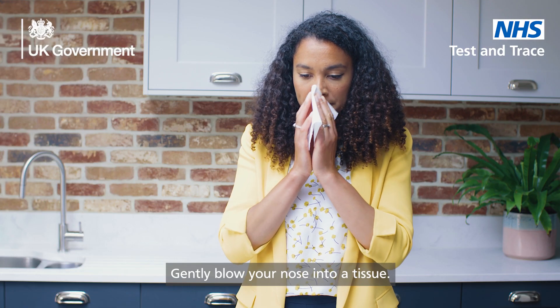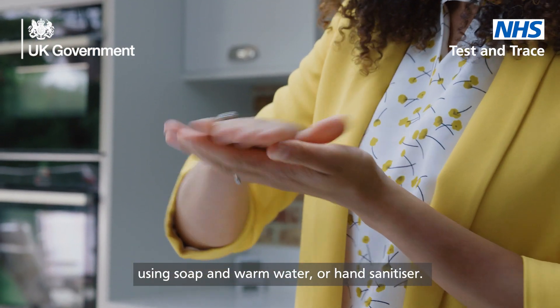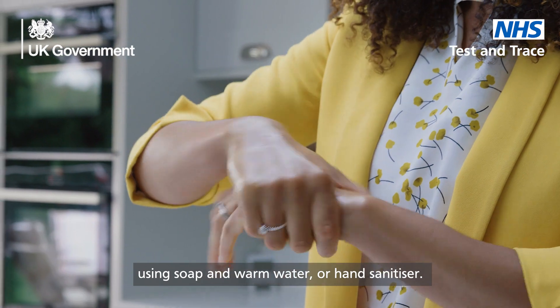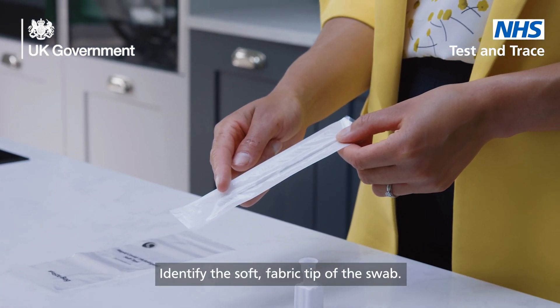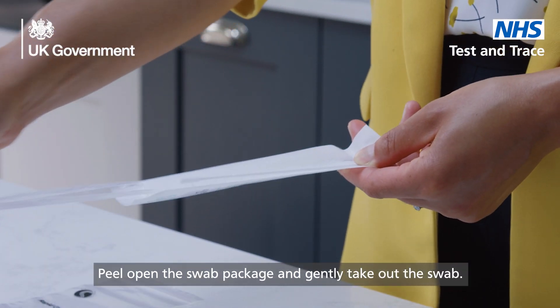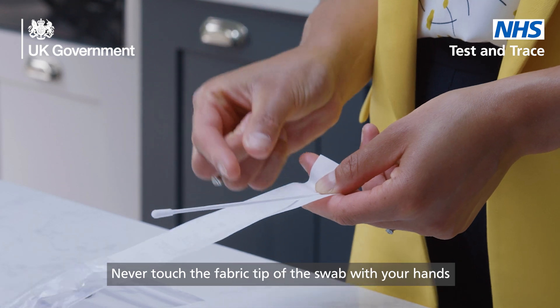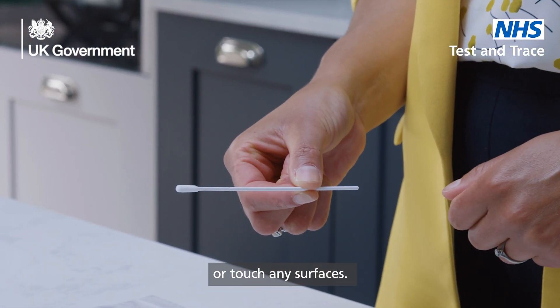Gently blow your nose into a tissue. Wash your hands thoroughly for 20 seconds again using soap and warm water or hand sanitizer. Find the sterile swab in the sealed wrapper and identify the soft fabric tip of the swab. Peel open the swab package and gently take out the swab. Never touch the fabric tip of the swab with your hands or touch any surfaces.